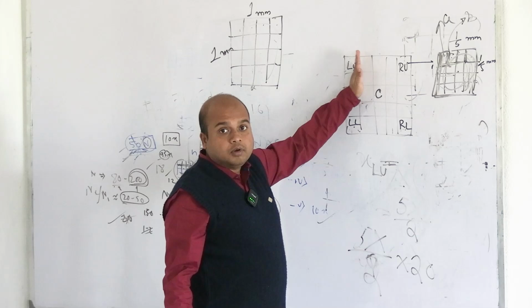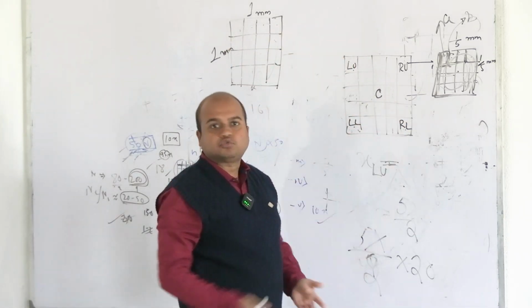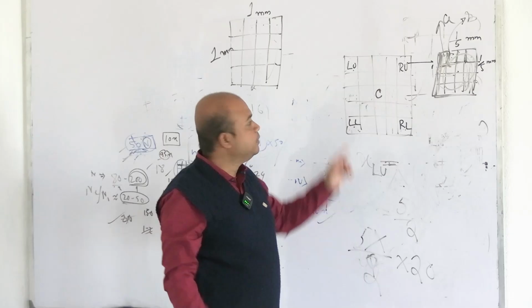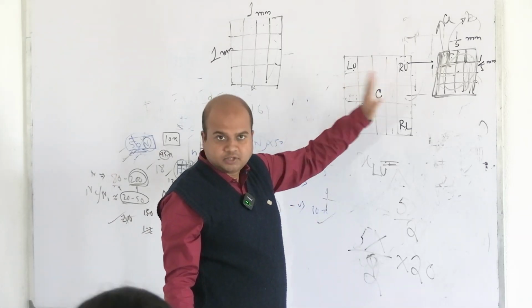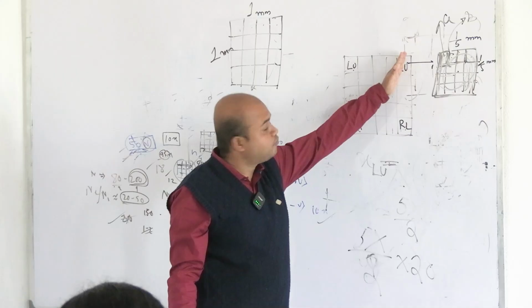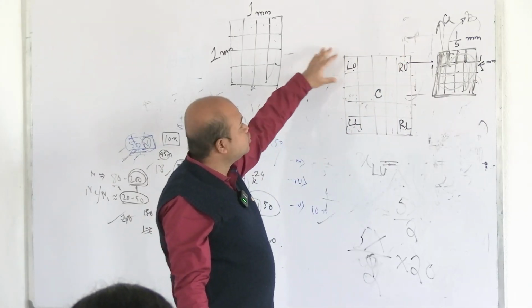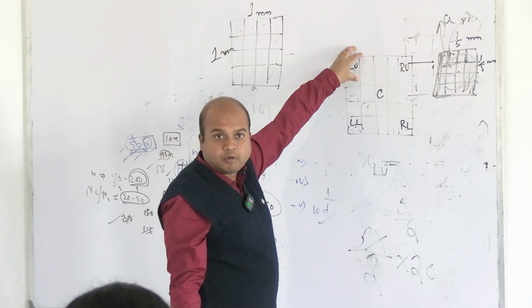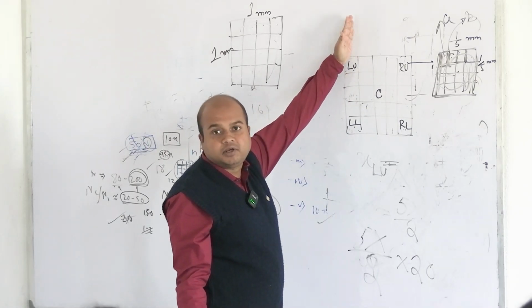Now what to do? In case of WBC, it was easy to move from left upper to right upper. There is just one triple line non-counting square in the middle. But here what to do? You have to move 3 squares. It is also easy, but move 3. The 4th one will be the right upper. Now identification is important. First one, conventionally we start from left upper. How to identify? On the left and upper side there will be triple lines.